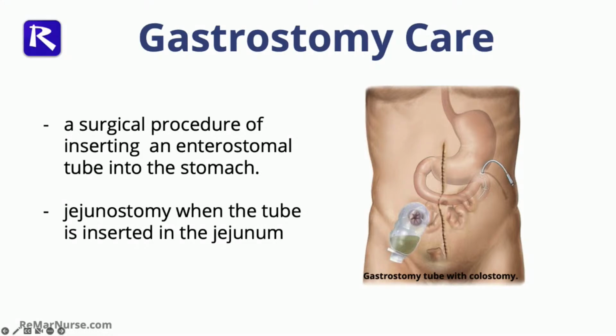This is important because the pancreas is not stimulated in the same way. Keep that in mind. I may have to do another video on jejunostomy tubes too, but we're going to specifically focus on the G tubes for this particular lecture.